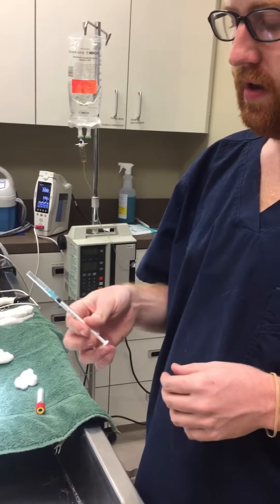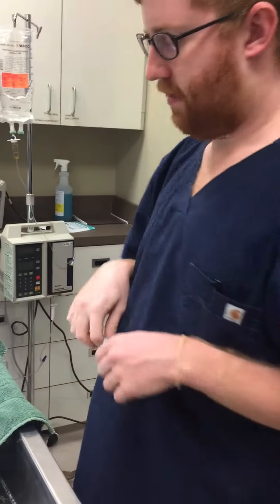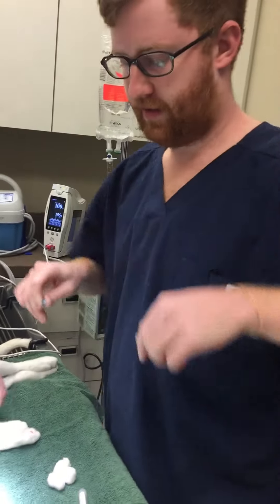I'm going to go ahead and break the seal on the syringe by pulling halfway back on the plunger and then pushing back, just to relieve any pressure that has built up. Since the cat is under anesthesia, proper restraint really isn't necessary.